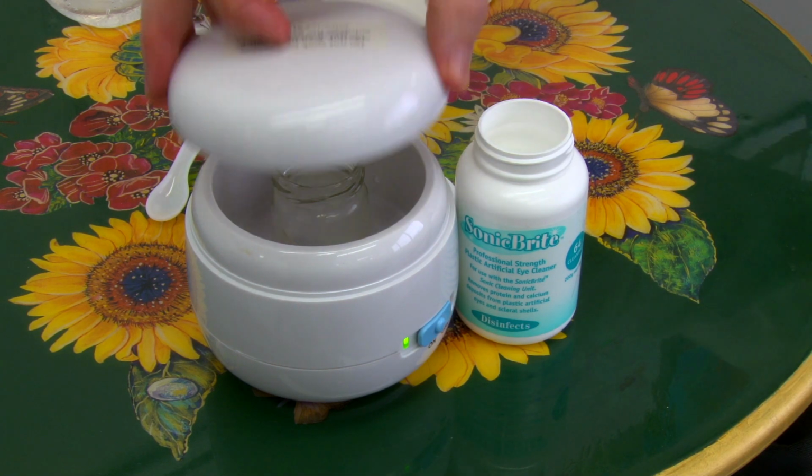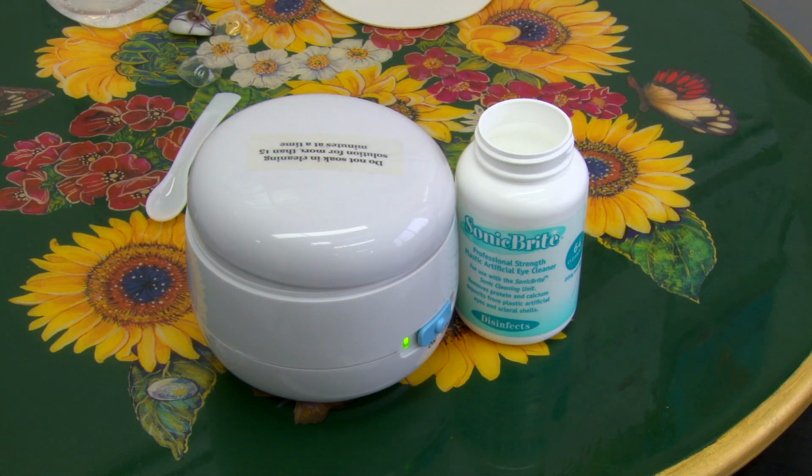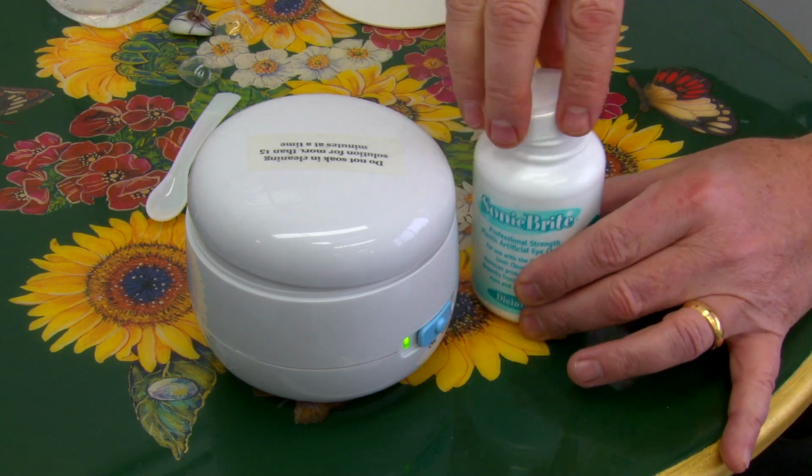So yeah, it's a bit like with your teeth. You can brush your teeth every day, but sometimes you need to do a little bit extra and go to the dentist every 6 months to get the plaque removed. This basically happens to your artificial eyes as well. You can get this plaque or protein that sticks to the surface, and maybe that needs a bit of extra effort to get it to come off.